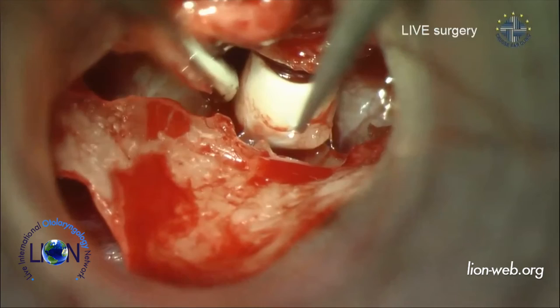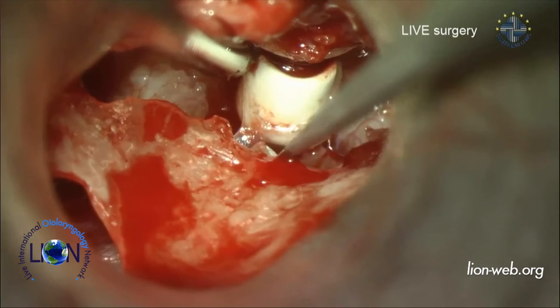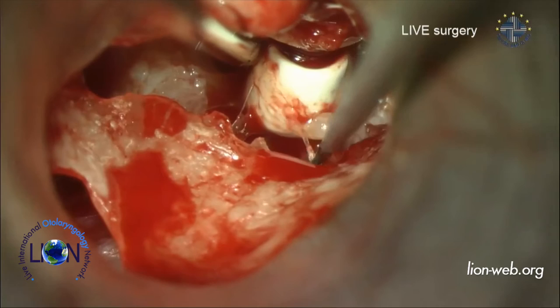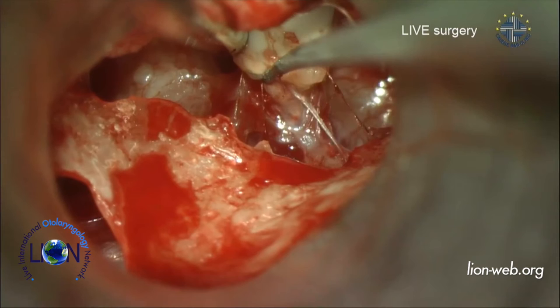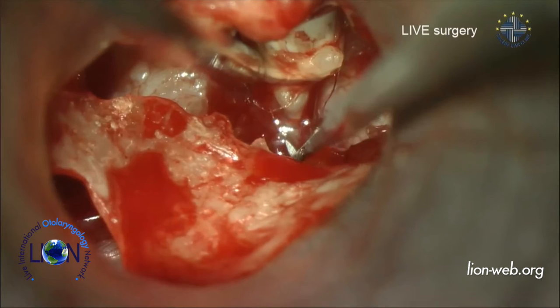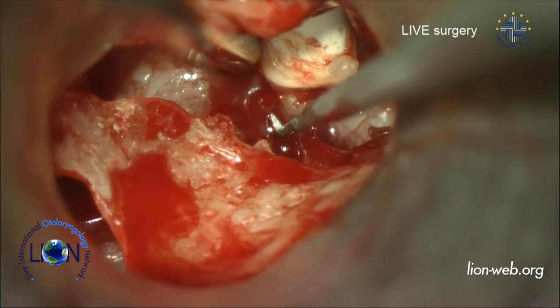Facial nerve on the left. I'll show you this and take some time to explain. The dehiscent facial nerve. Here. Perfect stapes, because I will do the Silastic banding technique, of course. And it's good because the flex never sticks as much as the dense hydroxyapatite. And here I'm in contact with the stapes and not on the left, as much as I can from the facial nerve.